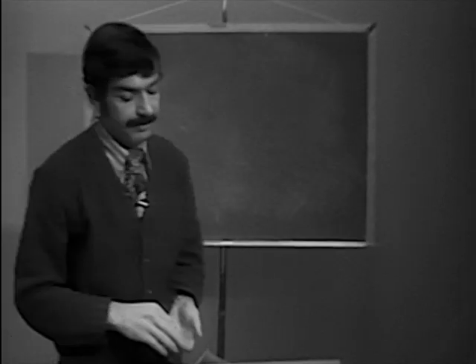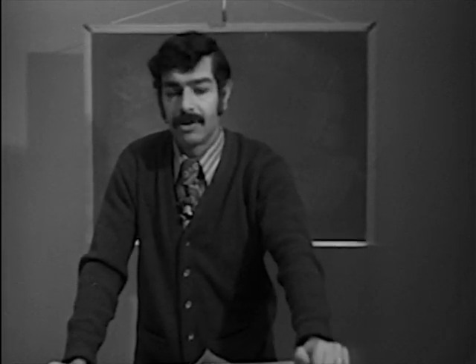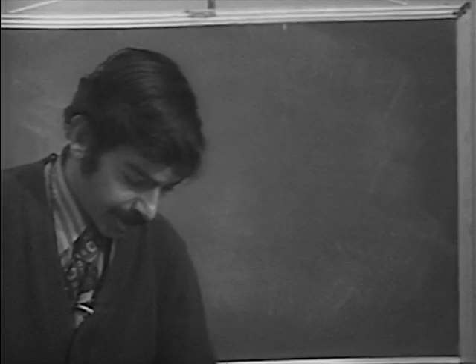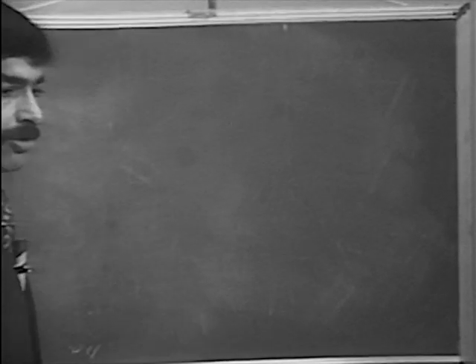Well, let's move on now, and let's review the taking of a normal electrocardiogram. Many of you have taken electrocardiograms, but there seems to be a little inconsistency in some of the details, so it's worthwhile reviewing that very briefly. Here's a patient here.